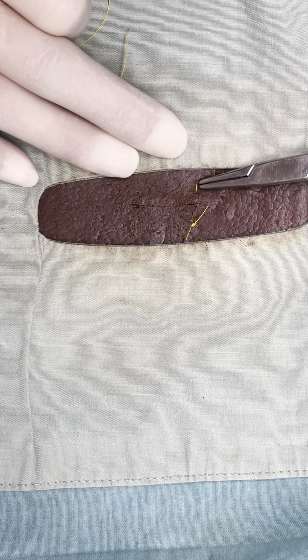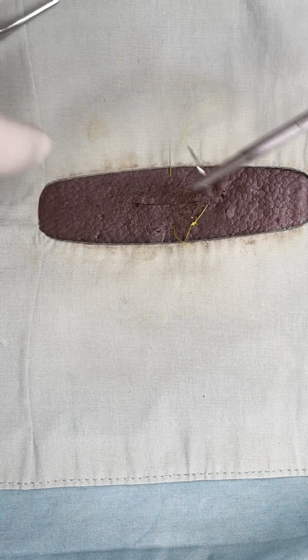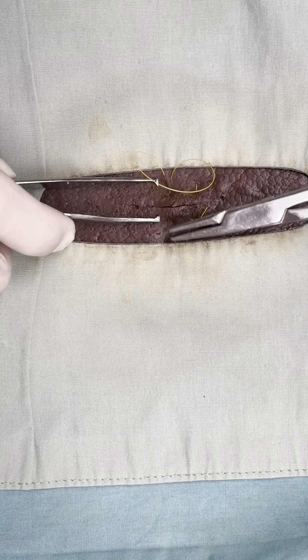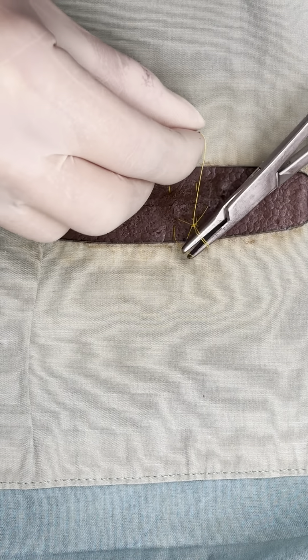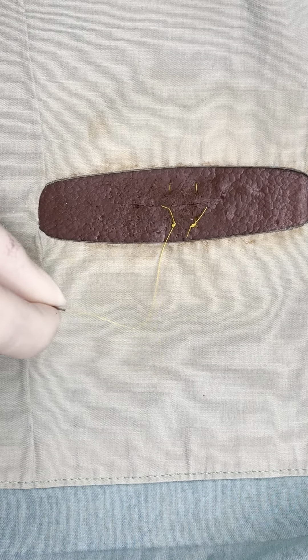So now you're going to have a vertical line on one side of your incision and a knot on the other. This is an interrupted pattern. You're going to enter on the side farthest from us, exit on the side closest to us, exit on the side farthest from us, and do a surgeon's knot and two square knots, and cut.